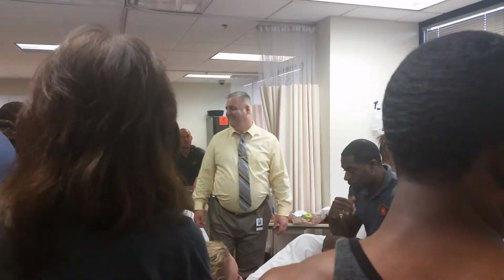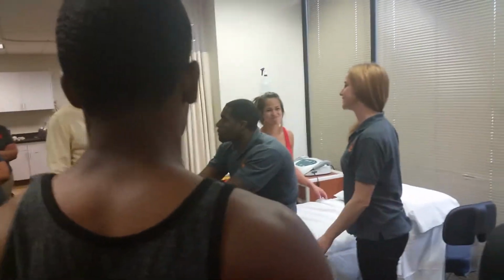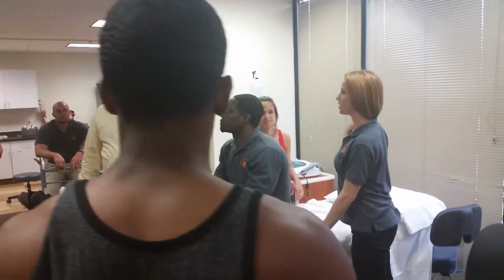We don't expect you to pick up a 200-pound man. I can try, guys. The sliding thing probably sounds a little easier for you. It is 12, so I know you have to go. Any things you want to point out before you leave?